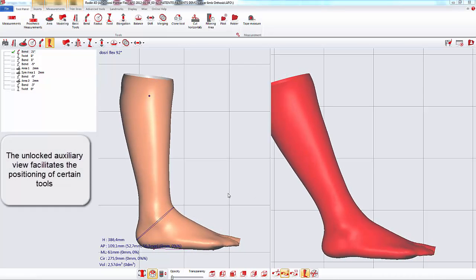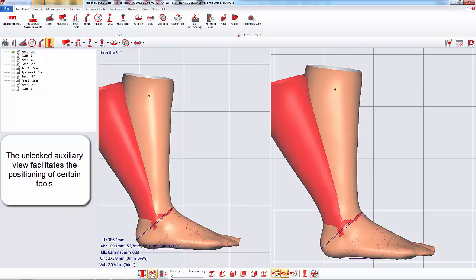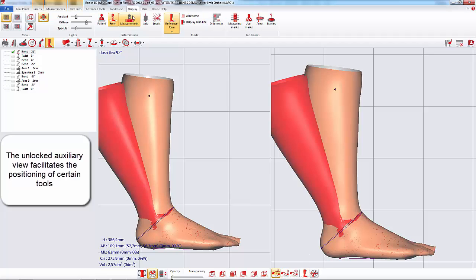The unlocked auxiliary view facilitates the creation of certain tools.